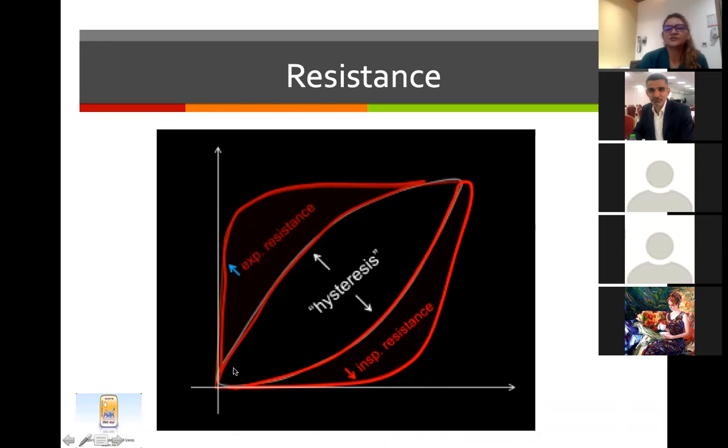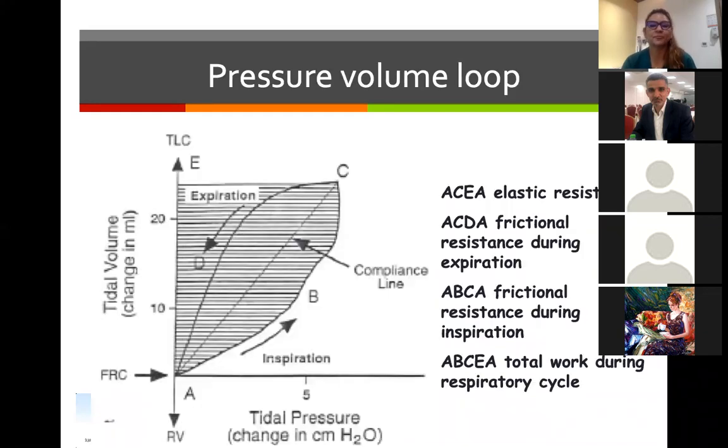In the center, you will see the compliance. And they don't have any correlation with each other. Compliance may remain the same and the resistance might increase. The resistance may remain the same and the compliance might reduce or increase. So you should know where to look.